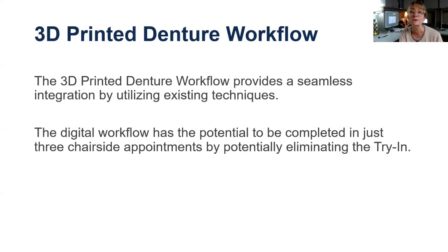Are you seeing less retention scanning tissue versus scanning an alginate? So really good question, and quite possibly so. The reason why we're discussing tonight either the copy denture or the reference denture versus scanning the intraoral cavity is because of the concern of lesser retention. And let me explain that a little bit.